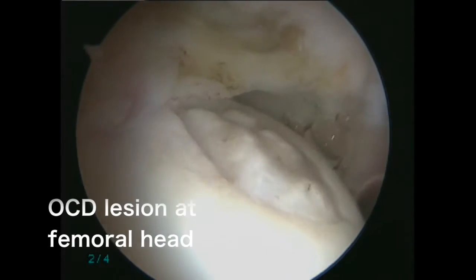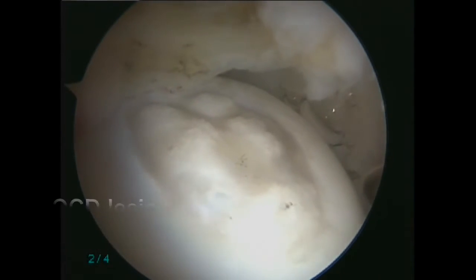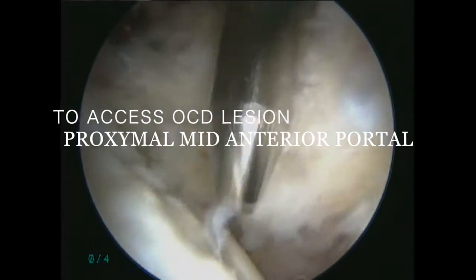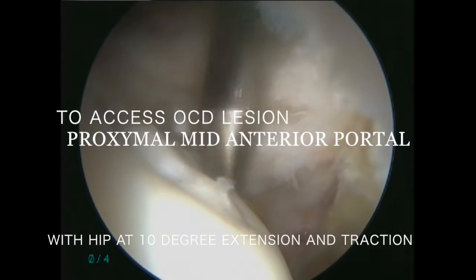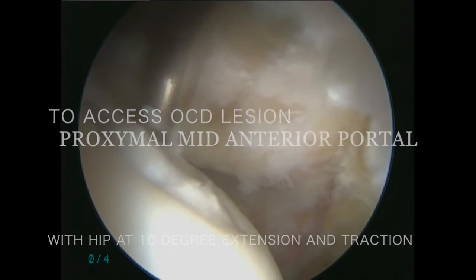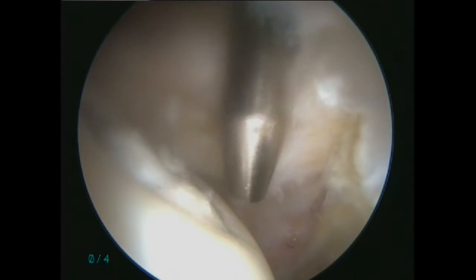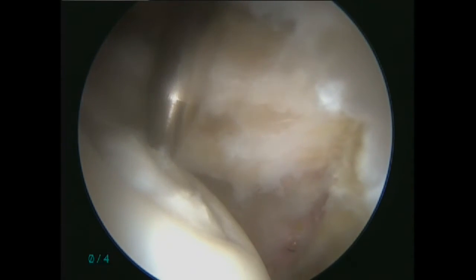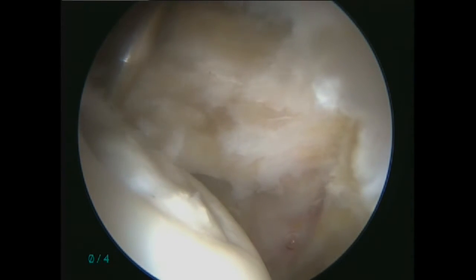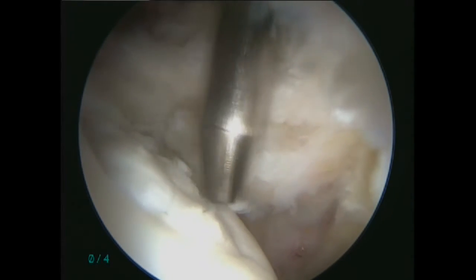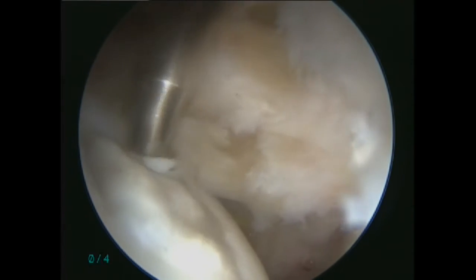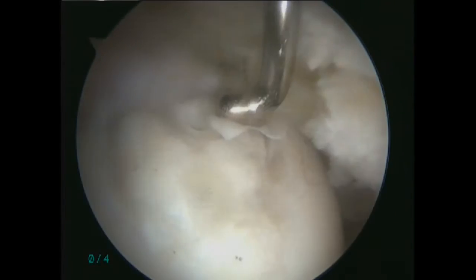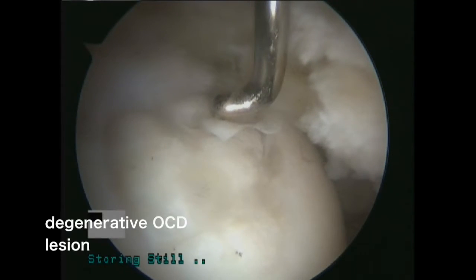The OCD region was observed at the anterior superior portion of the femoral head. A proximal mid-anterior portal (PMAP) was established to access the OCD region with the hip at 10 degrees extension and traction.